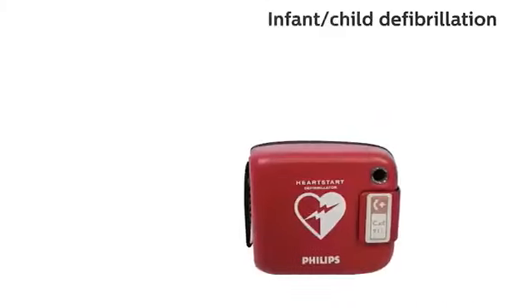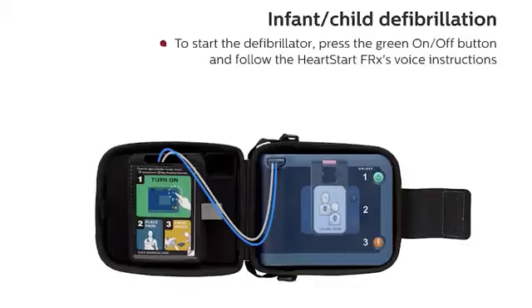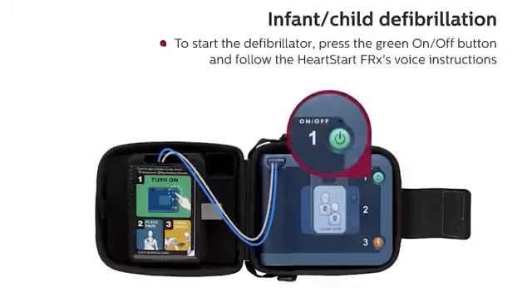To initiate infant child defibrillation, insert the infant child key. To start the defibrillator, press the green on-off button and follow the HeartStart FRX's voice instructions.